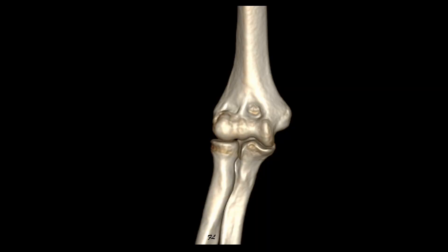Hello, in this module we will explore the anterior aspect of the elbow. Let's start with anatomy. The elbow is a complex joint that is made up of three joints sharing the same capsule.